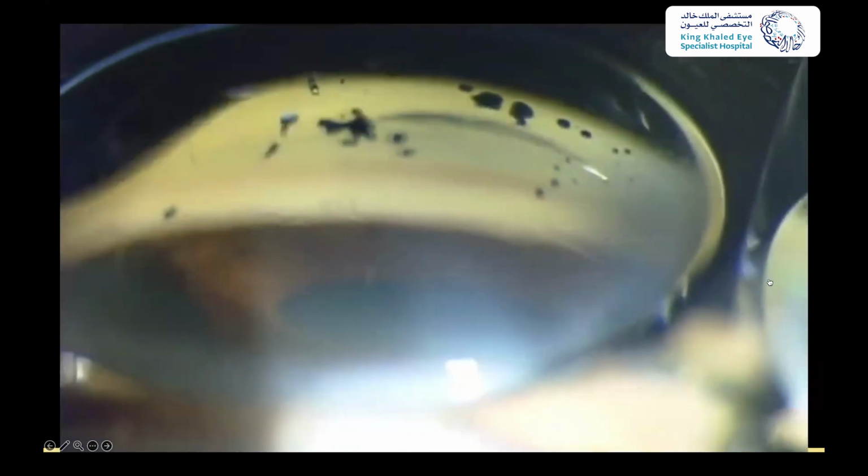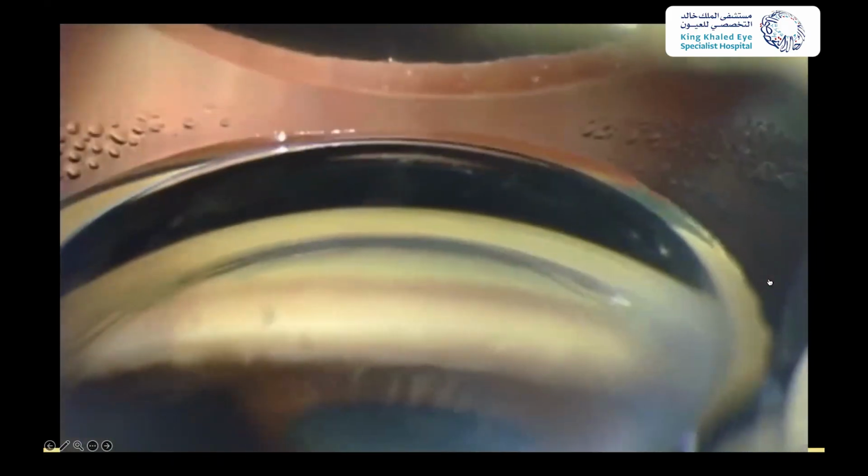And then when we indent, you can see all the way down past trabecular meshwork to scleral spur. So this is an eye that has appositional angle closure, opens really well with indentation. So you would expect with an iridotomy or lensectomy, their angle would be open, not necessarily wide open.